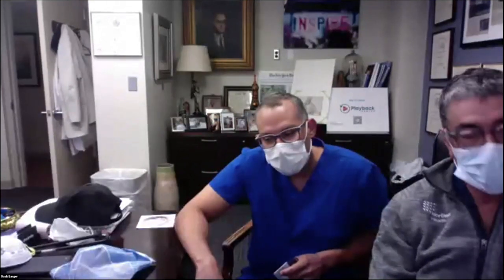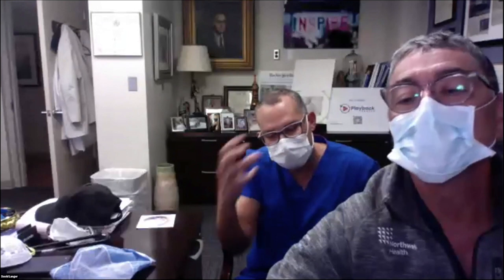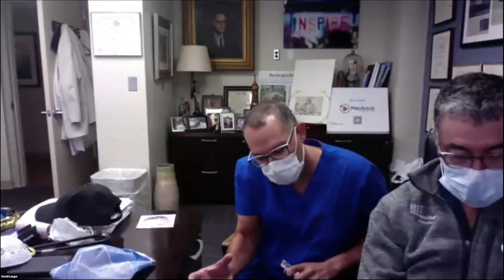Initially, I put a coil trying to include the entire aneurysm. That's the usual way we coil this aneurysm. So we sized it. It measured like 7 millimeters in the maximum length. And so I used a 6 millimeter coil so that it didn't protrude into the normal artery.